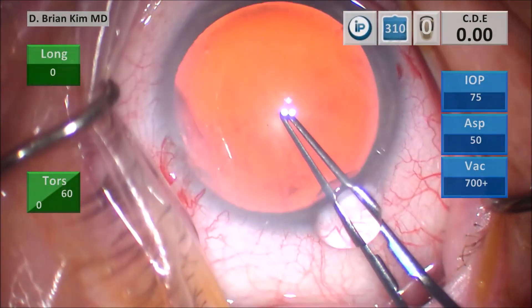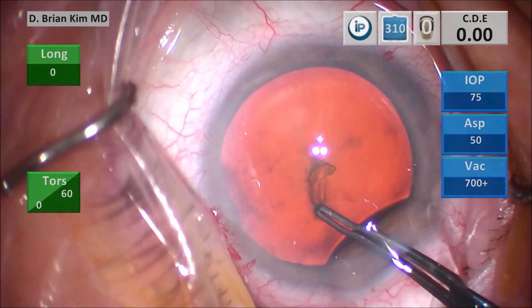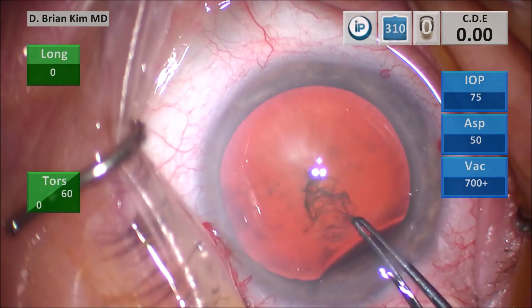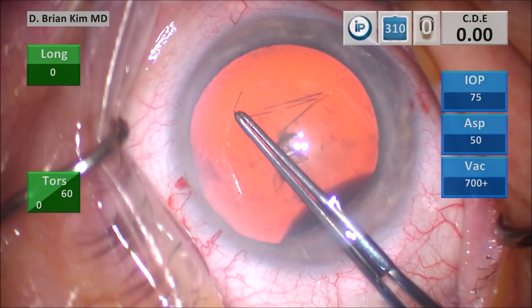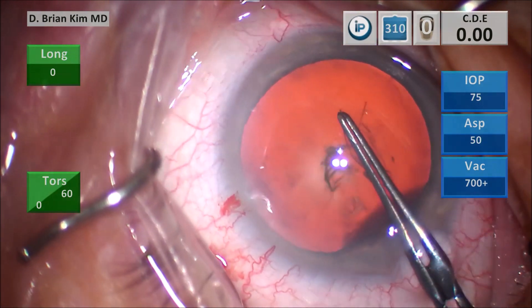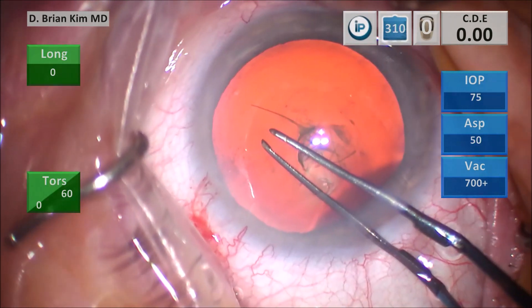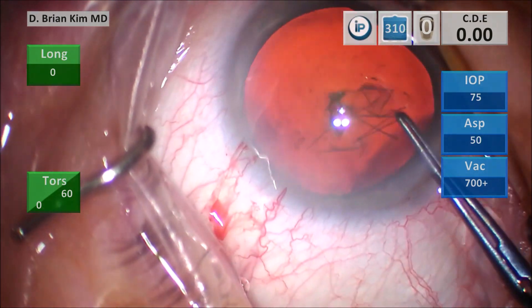I'm going to use my rhexis forceps to puncture the center of the capsule, pull downward and then sweep a little bit to the right to create a small flap. Once I create that flap I'm going to use the corneal mark that I did before to help me center and size my rhexis. I'm trying to go around circumferentially making sure the diameter and circumference of the rhexis is equal along the way, centering and sizing it over the corneal marking, and then I burp the viscoelastic out of the eye.